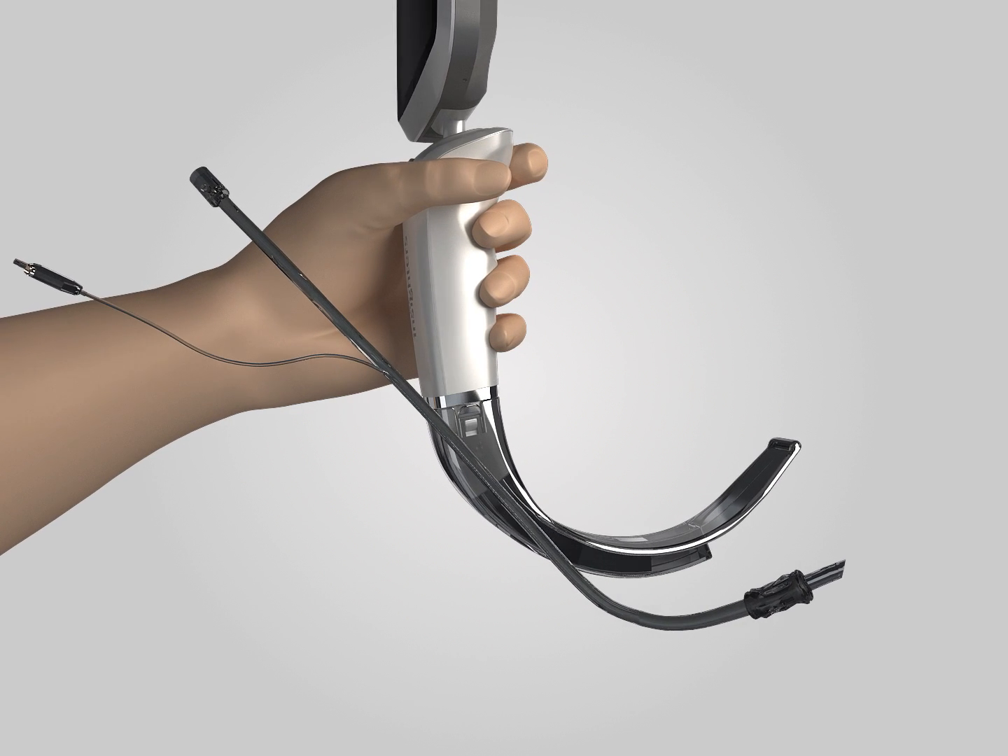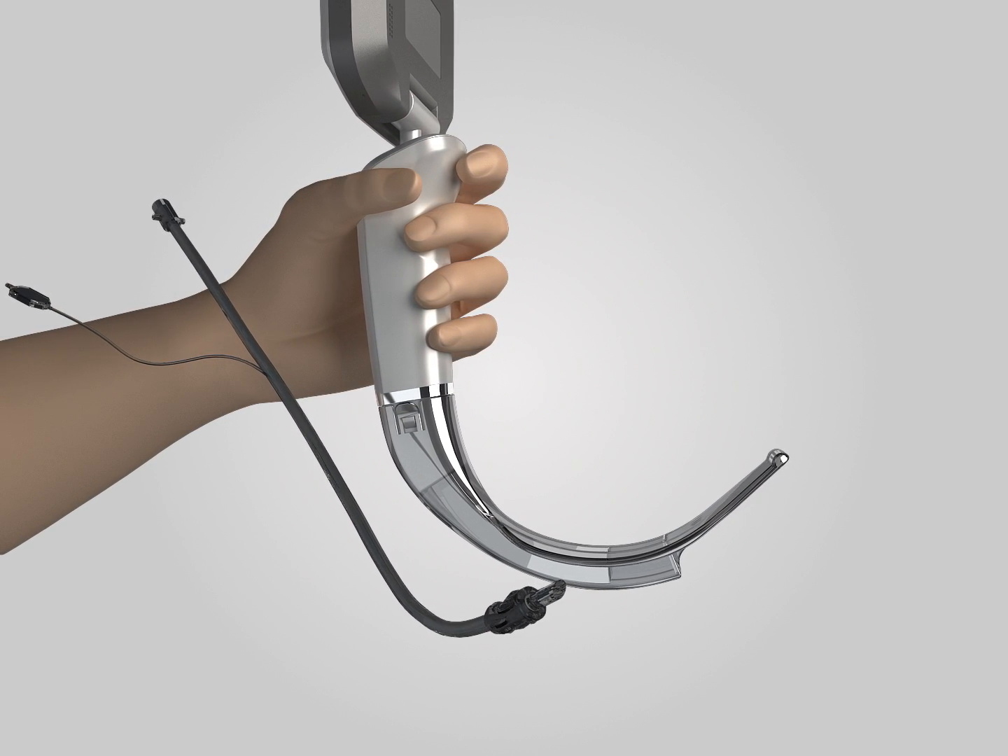3. Use shapers to shape the endotracheal tube with the front end of the tube in line with the front end of the blade.